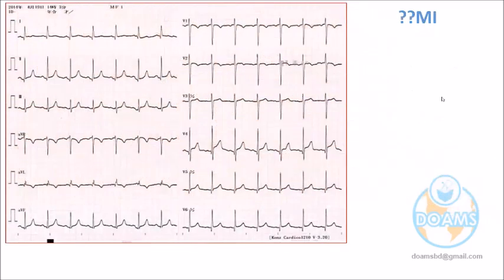Is it MI? Quickly, doctor. You are confused, right? This is ST elevation there, in lead 4. But in lead 5, it is difficult to say. In lead 3, normal. Yes, Dr. Femina, possibly telling something. And here, lead 1 and aVR, a little R wave is there, a little R. T inversion.